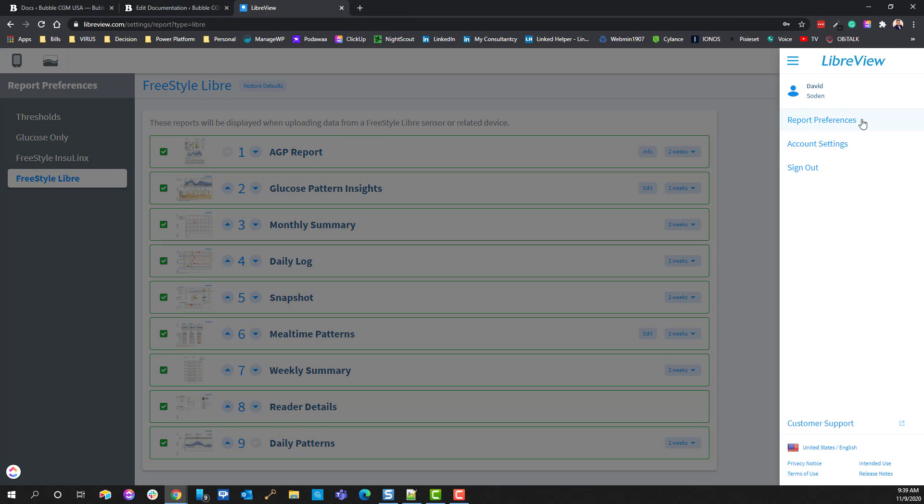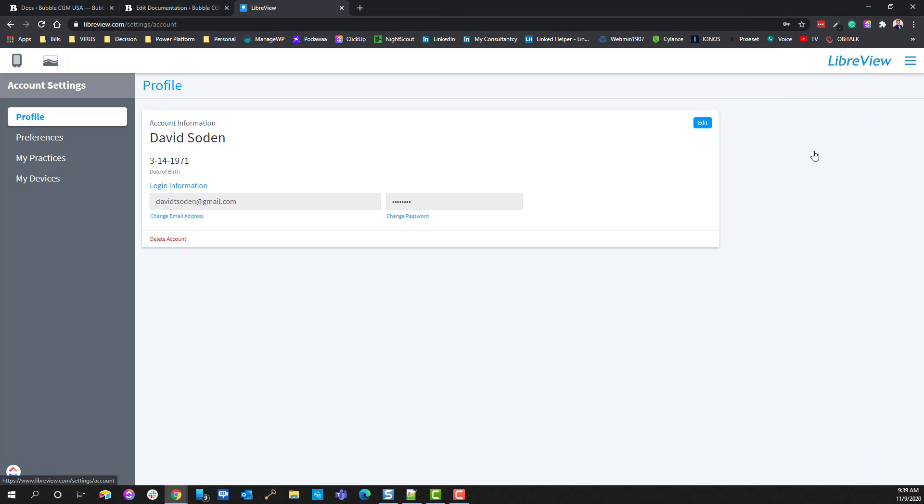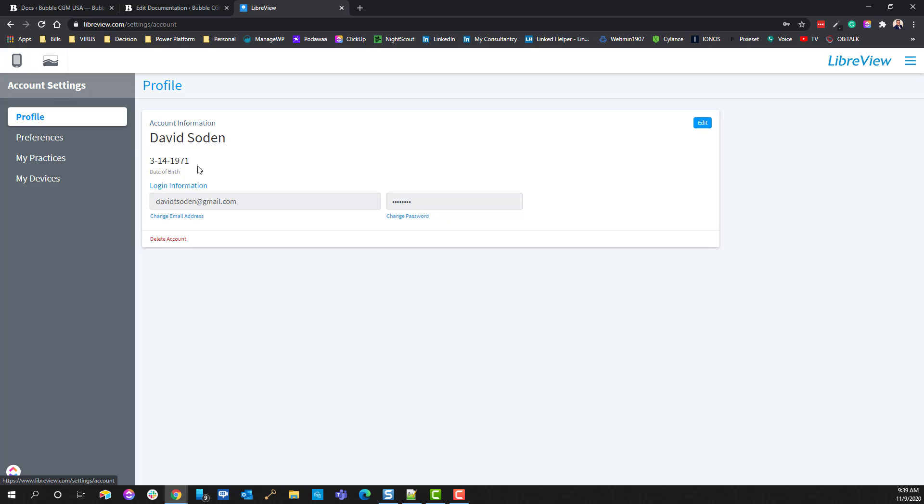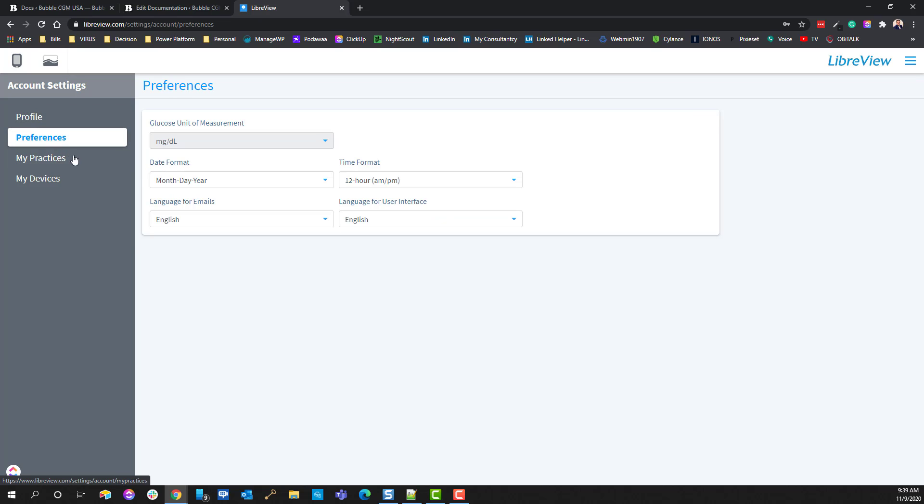The next thing to note are the account settings. Under here is your general profile, which is where you can change your email address and password. You also have preferences. So if for some reason you want to change the unit of measurement that you'll have set up initially, you'll want to go ahead and use this. Here in the U.S., chances are it's always going to be MG/DL.